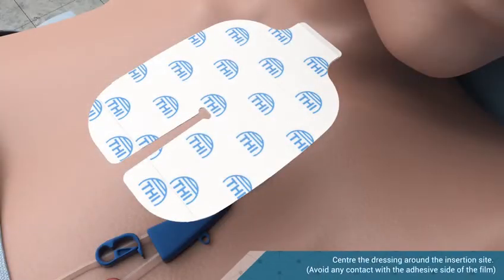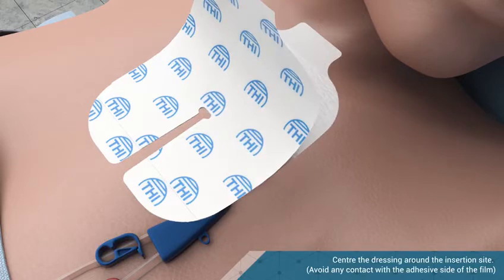Peel off the layer of silicone paper by pulling on the upper tab in the non-adhesive area or the area below this.